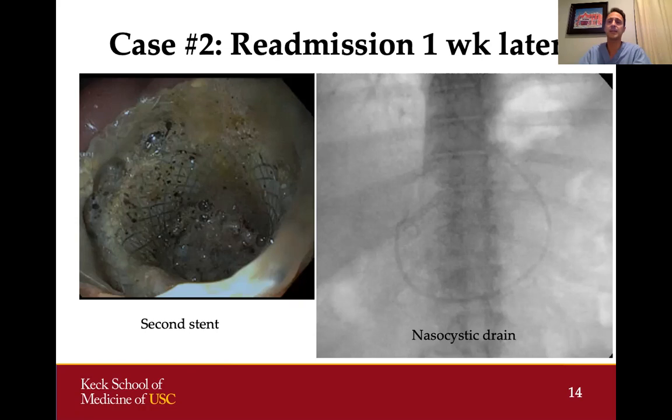We chose to place a second lumen-opposing metal stent in a different part of the cyst while leaving the first stent in place. This allows for more drainage and creates a second area where the cyst can drain if the first stent gets clogged with necrotic material. It also allows us to place a nasocystic drain through one of those stents into the cyst cavity — a small plastic drain going through the nose, down into the stomach, through the stent, and coiled up in the cavity.